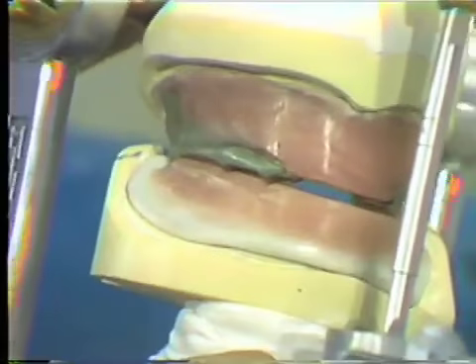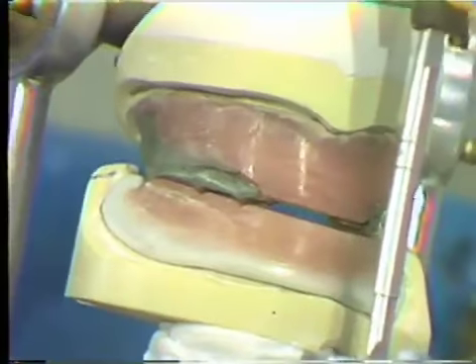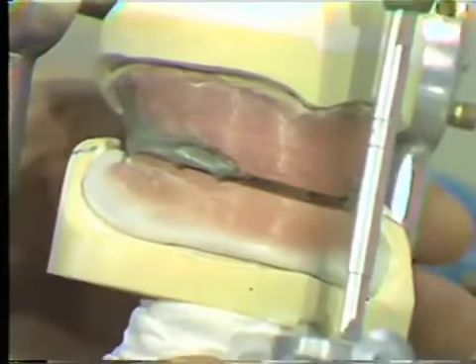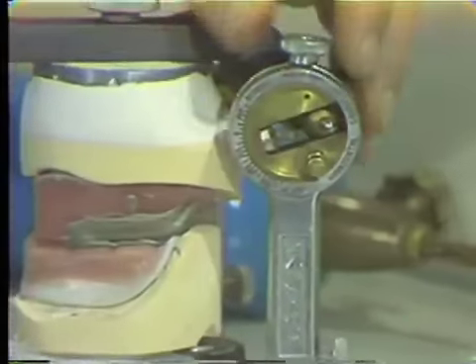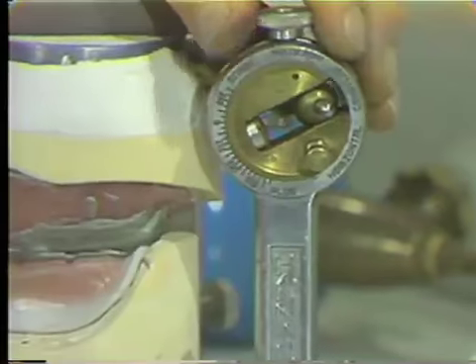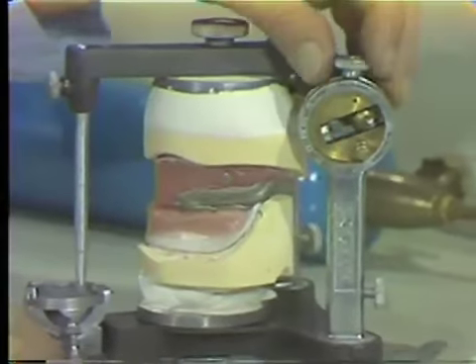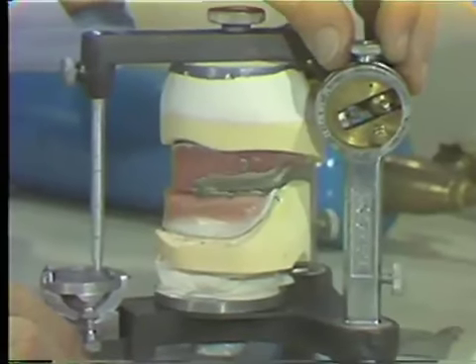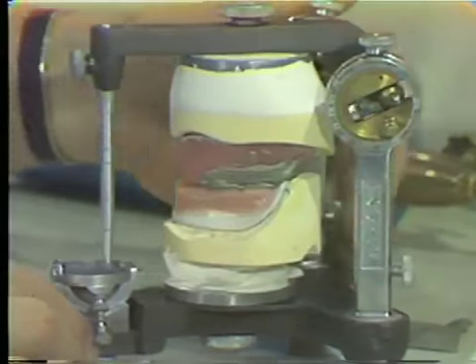Now at that position, the anterior is apart, so we must move the condylar mechanism until we get a uniform seating. When we go to the other side, note the incisal pin is not touching, because if that touches, then it will disrupt the complete seating.